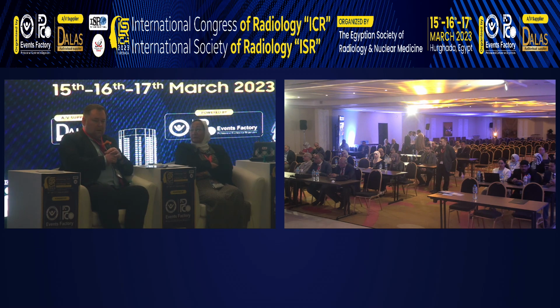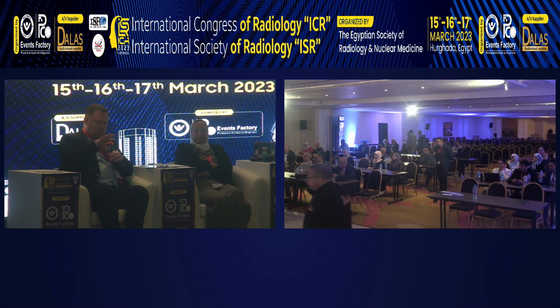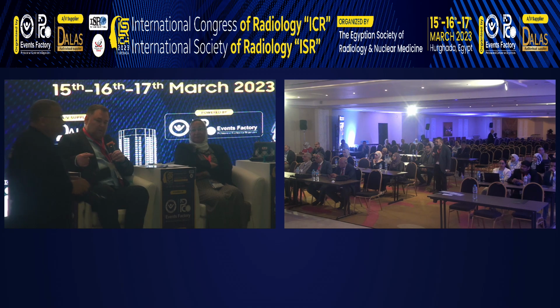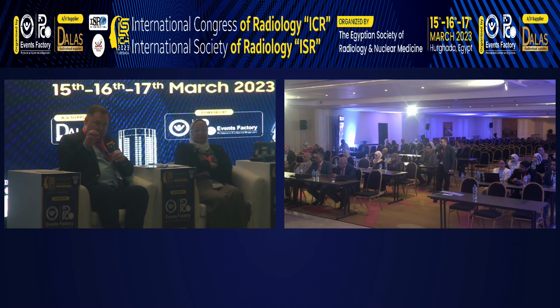So yes, there are 2 different things, also 2 different substances. What you are talking about, the lymph node diagnostics, has a bit different principle than the liver diagnostics. If you want to have a lymph node phase, the lymphotropic phase of the USPIOs, ultra small particles of iron oxide, you have to wait 24 to 36 hours. Why? Because the biological ability of the nanoparticles is such that they are, to be honest, not that attractive for macrophages to be eaten.